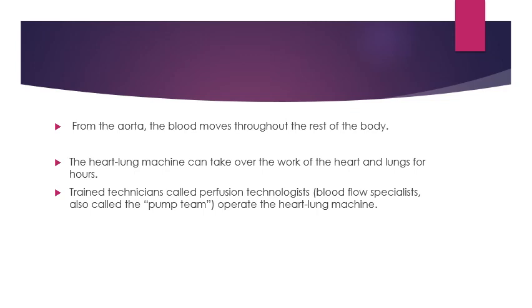From the aorta, the blood moves throughout the rest of the body. The heart-lung machine can take over the work of the heart and the lungs for hours. Trained technicians called perfusion technologists operate the heart-lung machine.